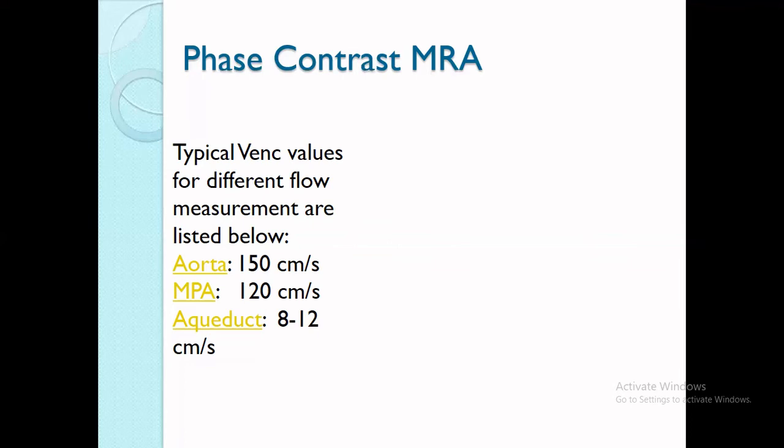This aqueduct is very, very important, because at certain times internal CSF pressure rises in certain children as well as in a lot of patients. So in order to see the flow within the aqueduct, we need to know what the velocity of the aqueduct is. This is very important for studying the CSF flow around this particular CSF system.